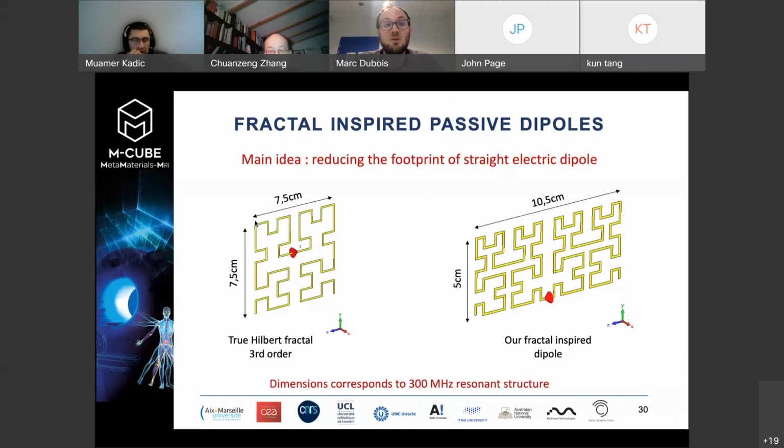So that's a moment where you can make structure that can be resonating at 300 megahertz, for example, for proton. And because the gyromagnetic ratio of each of these nuclei is different, then you have the phosphorus, it's probably 120 megahertz, the carbon is 60 megahertz, and so on and so forth. So you can have different frequencies if you use different nuclei. But for really just the imaging in the most basic operation, most of the time it's the proton frequency, and that's the only one you care about.